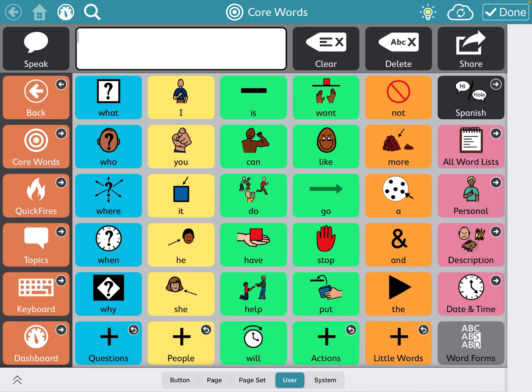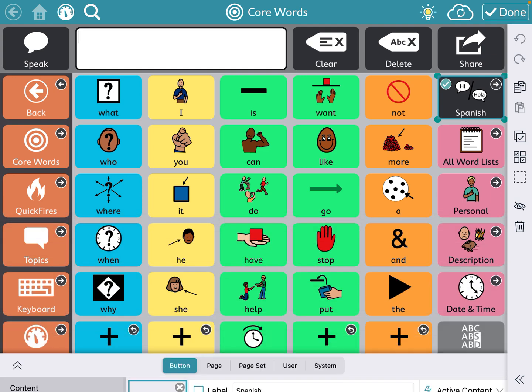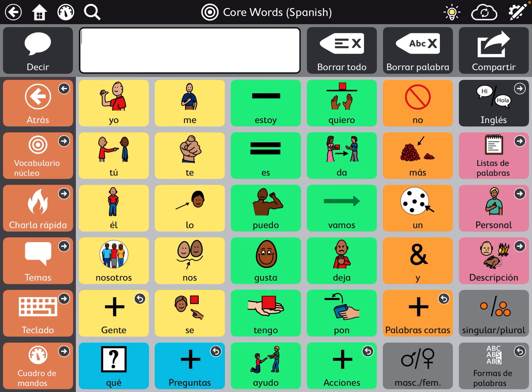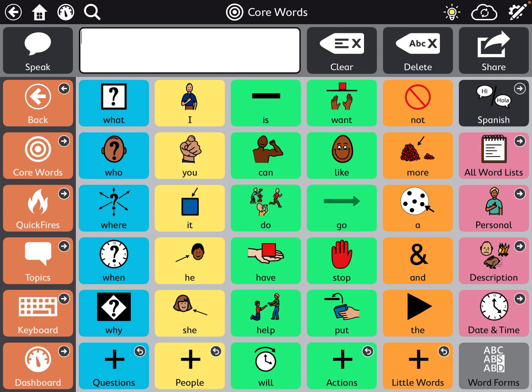Once you're in here, you'll see that in the top right-hand corner, right under Share, there's a little button that says Spanish. Click Done to exit editing mode, and it will switch everything to Spanish, making it a bilingual system. They try to keep similar motor plan positioning, but some words change depending on whether they're English or Spanish, since English and Spanish core are different — but they do their best and it is a pretty good bilingual system.